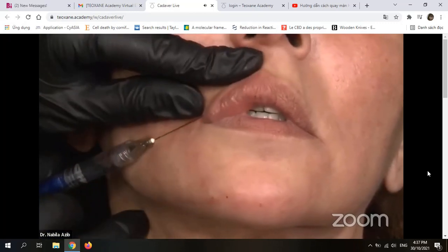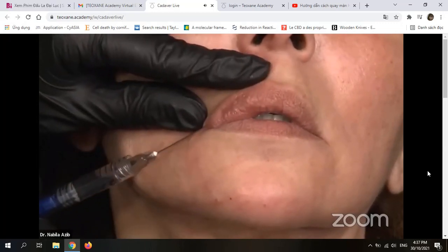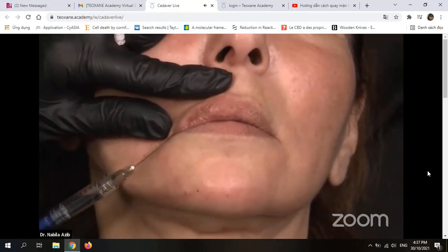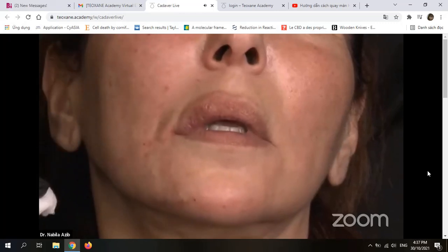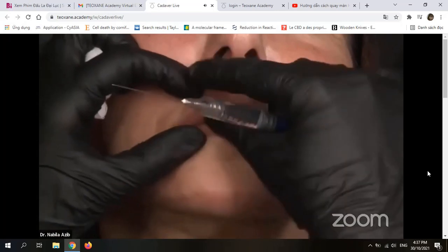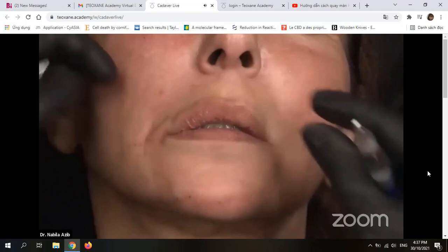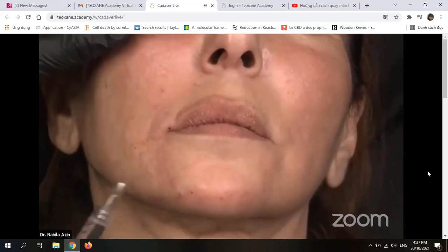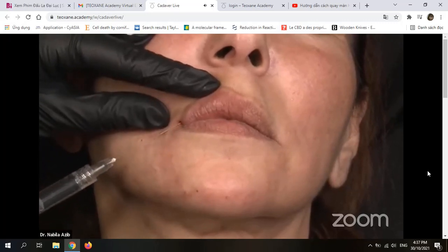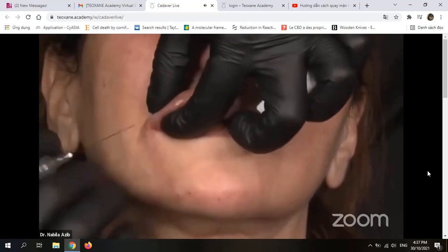Can you ask your patient, is it painful for her? Linda, is it painful? Tell the truth. On 10, it is painful. Yeah, in the beginning. Only in the beginning. Okay, thank you. Because of the vermilion border, it's quite superficial, and all the papules or very superficial injections are more painful than the deeper ones. But now that she has had the lidocaine, she doesn't feel it anymore.